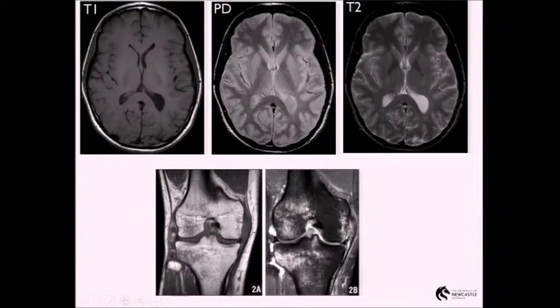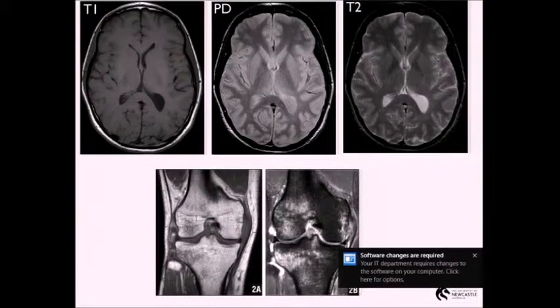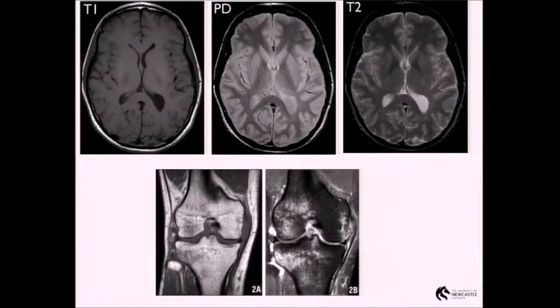All this white here is basically showing us that there's edema within the bone, and that's a very characteristic pattern that we get for someone that's had an ACL injury. So typically what happens when they damage their anterior cruciate is the two bones come together, and then they'll have a kissing injury and then twist. The kissing injury will give you this pattern down here where we've seen some bone edema, and when they twist, it's that twisting motion which will tear the cartilage and characteristically tear the ACL.